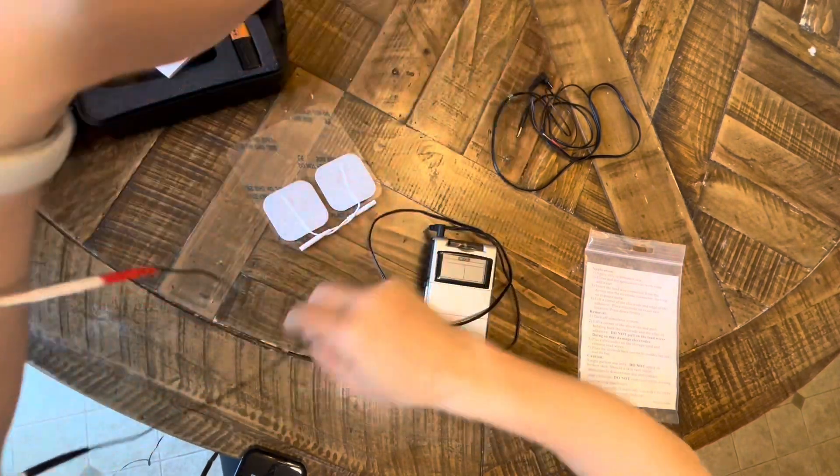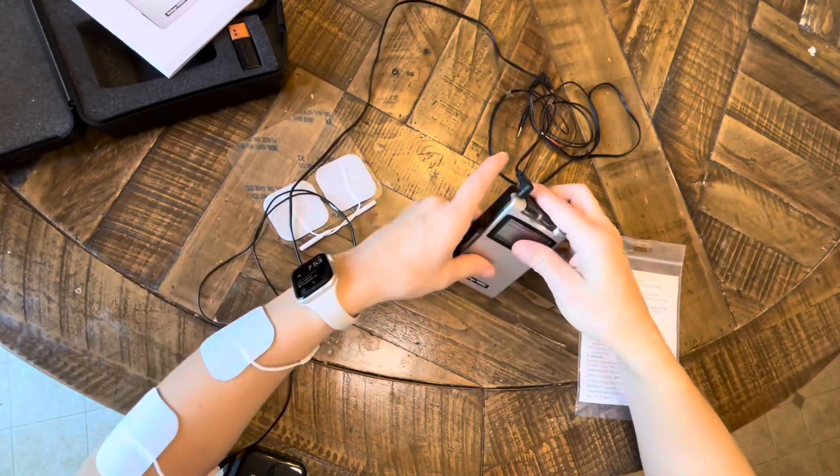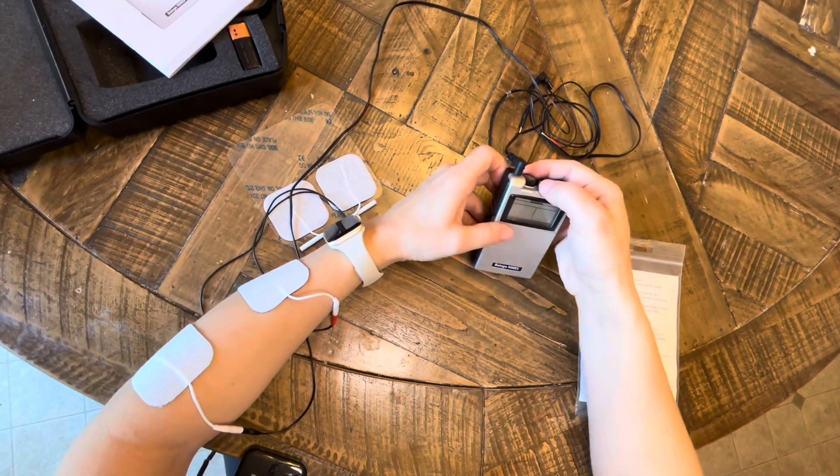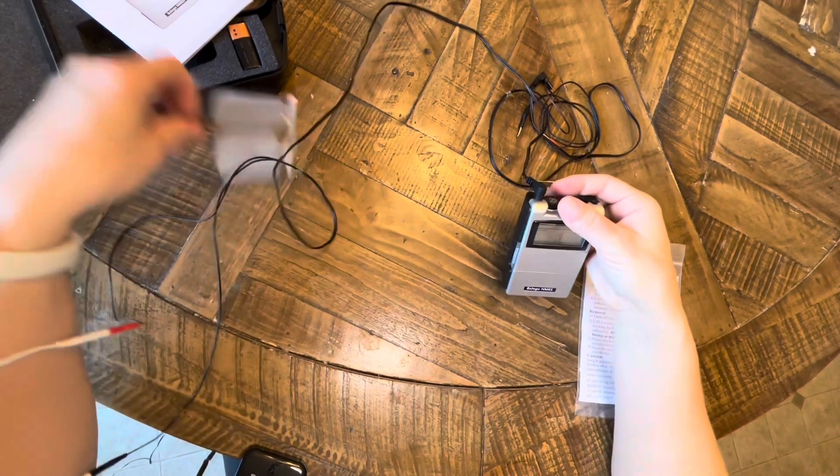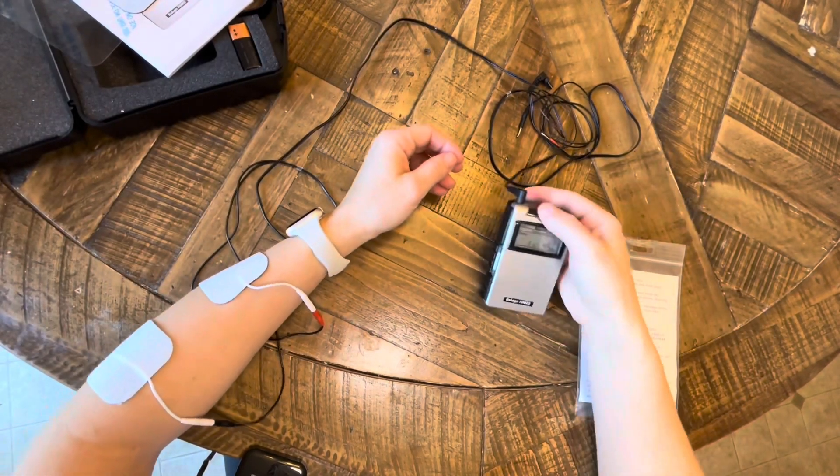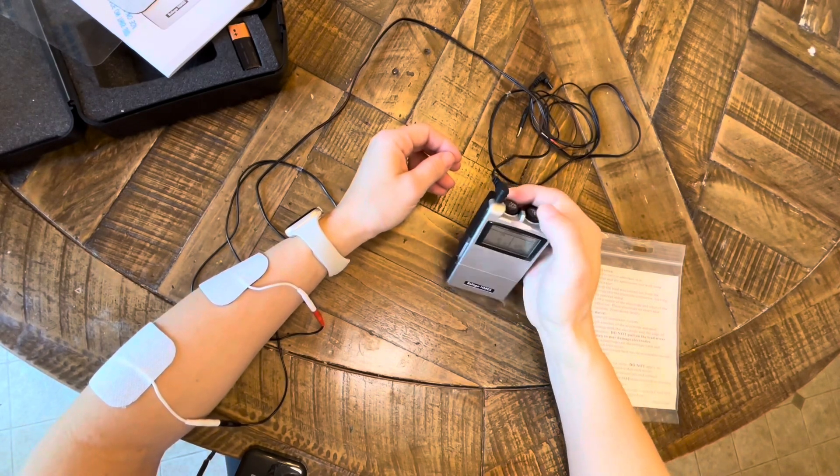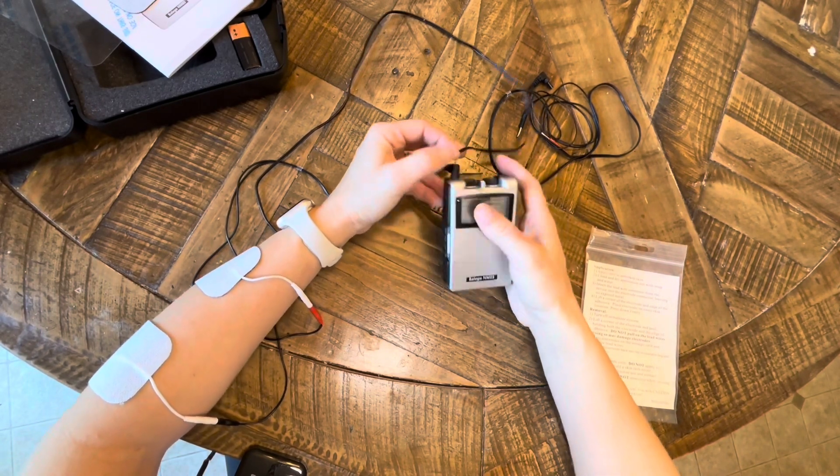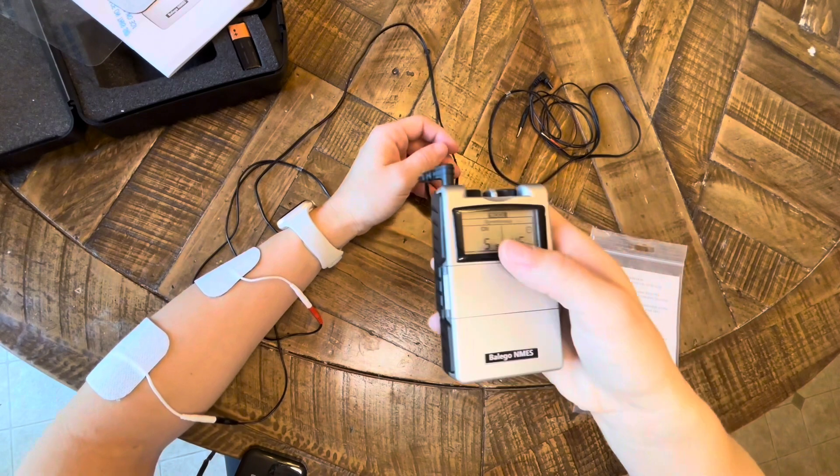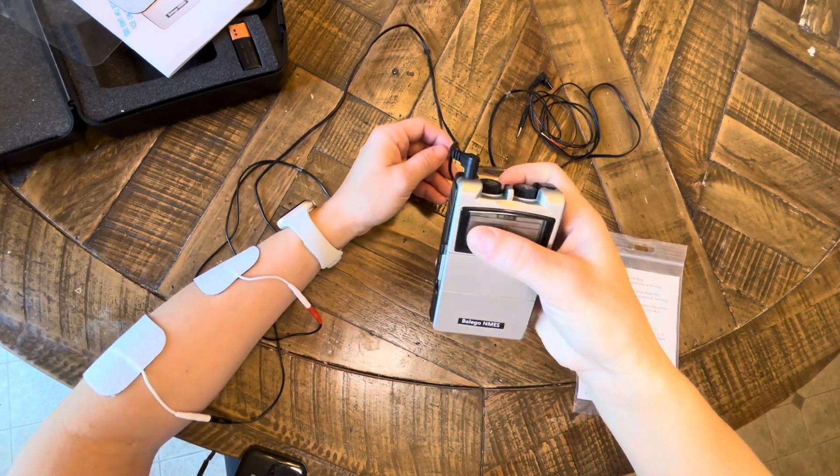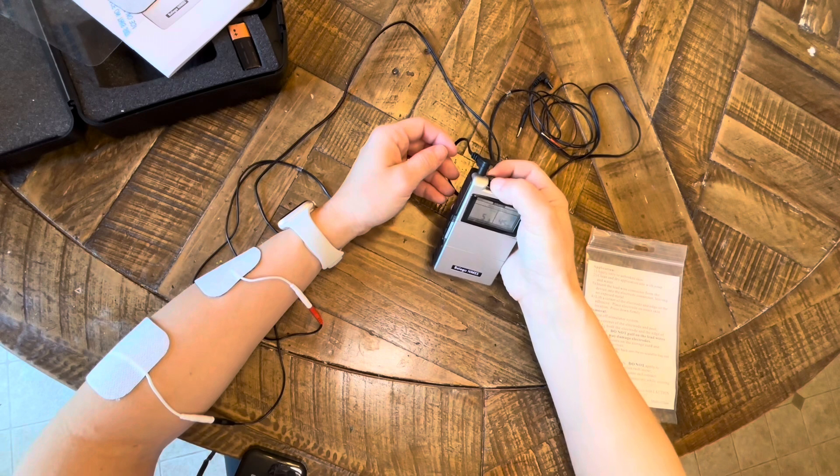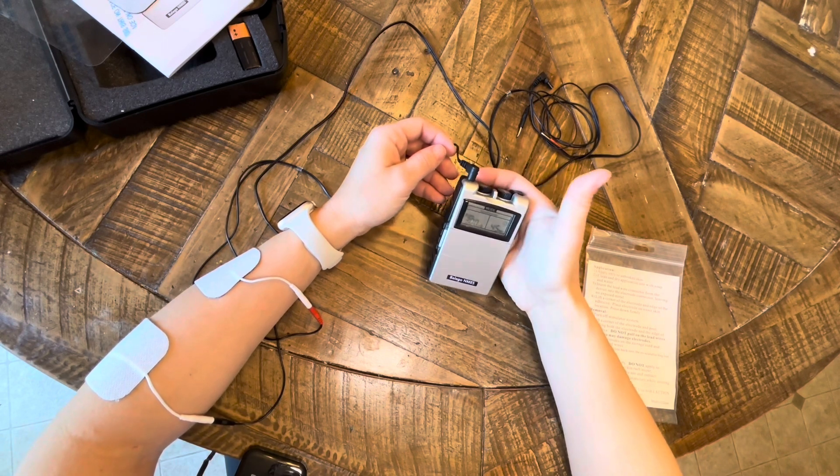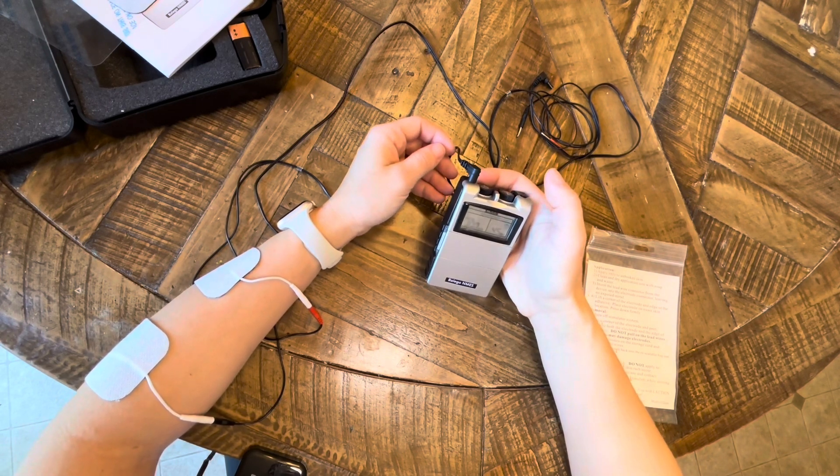So now that my electrodes are on and everything's connected, I'll turn the dial to turn it on. All my parameters are set to the same thing that it was when I last used it. The CH—that's for channel—that will flash when my e-stim is on, so that's when I will actually turn up the intensity.